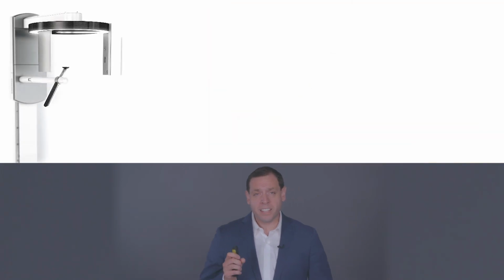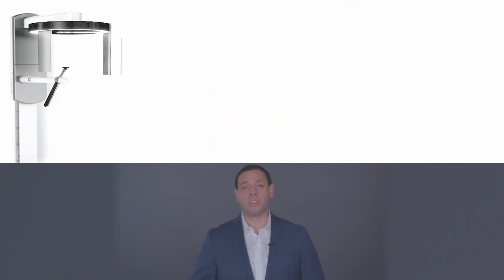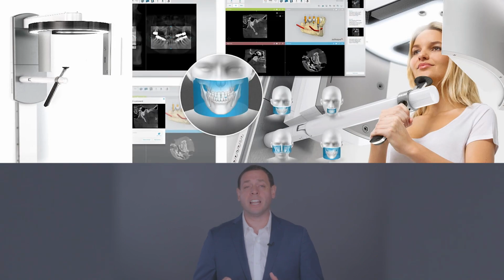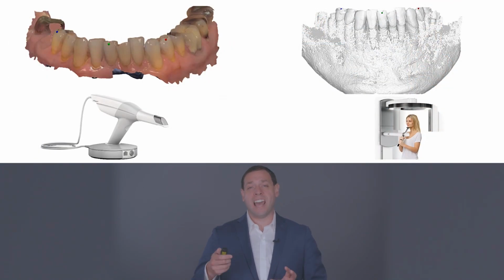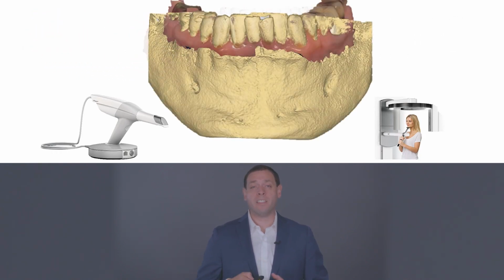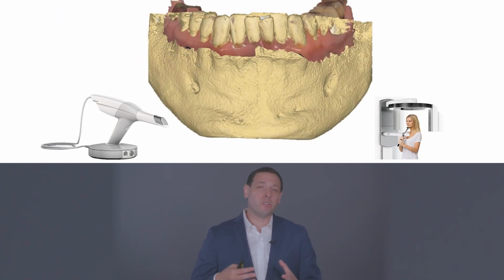So the next foundational tool that we've always worked with is the 3D X-ray. The 3D X-ray technology has improved the dentistry that we do and the integrations that we do, because it allows us to incorporate that other side that we don't normally see, which is underneath the tissue. So in a traditional case like what we see here, where we're going to be using it for implant planning, we're going to do alignment dentistry, where we align the surface scan with the 3D scan, and this gives us insight. And this has been a very traditional technique.